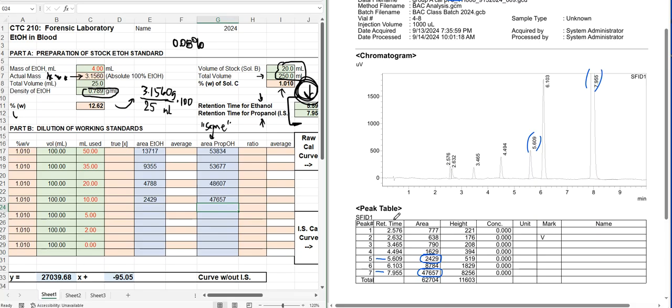So did the same person make both of those? If so, then maybe their pipetting skills do need work. These were run back to back in the machine, probably at standard number 4 and standard number 3. So was there a little hiccup in the instrumentation during that time? Maybe. But again, we can correct for that, and we'll see how this fleshes out in just a minute. All right, so there's standard 3.